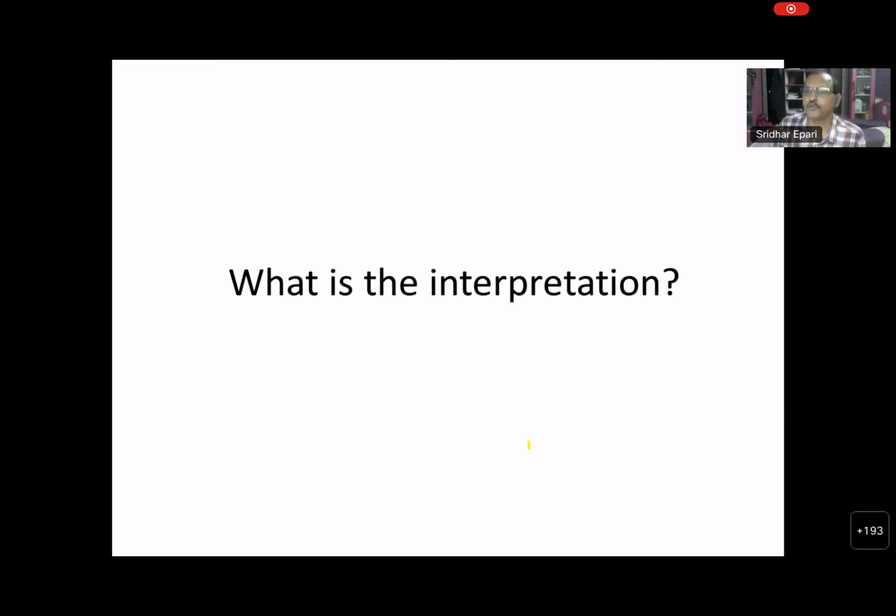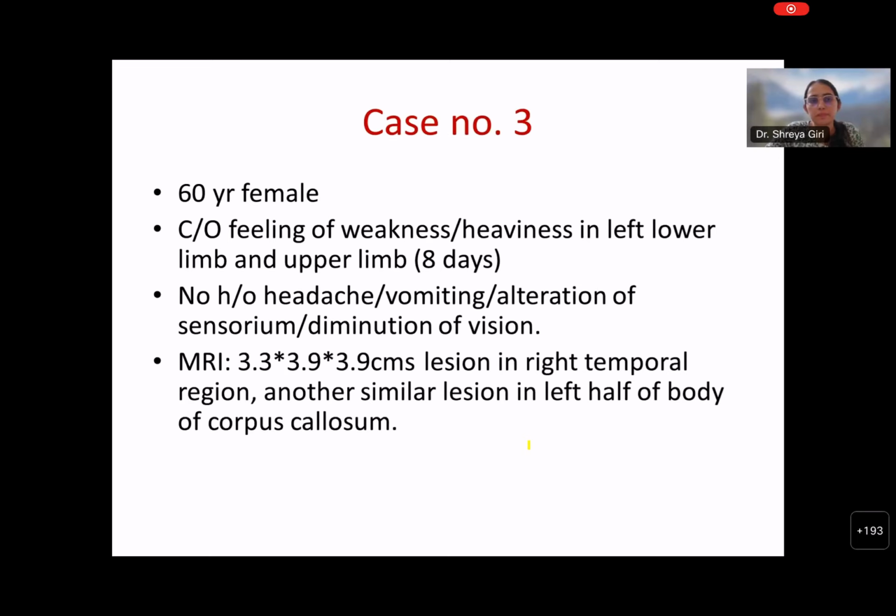So you saw two different cases. In one case you picked up a typical IDH mutant by IHC. In the second case you had a phenotype of ATRX loss and p53 mutant. In those kinds of cases, you should always advise sequencing before you call it IDH wild type. Okay. The third case now.